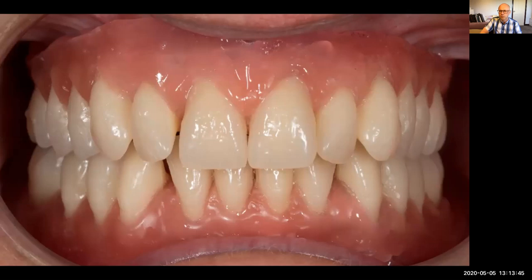So here we've got the wax try-in, which we then do a video of the patient. So Lynn will have a video with that in place, talking away and verifying it and making sure we're totally happy. But I do want to mention just one thing here about uppers.